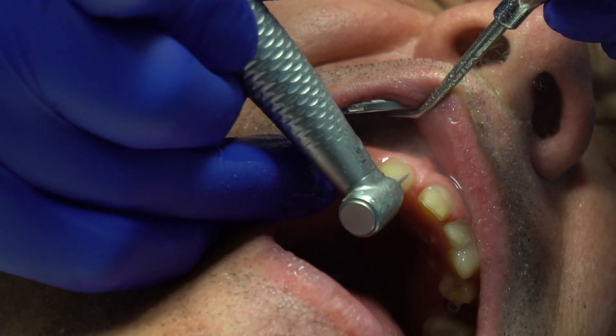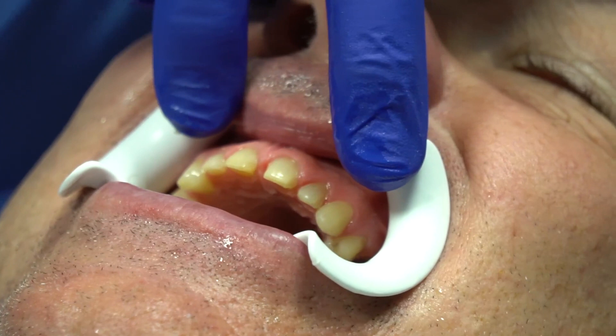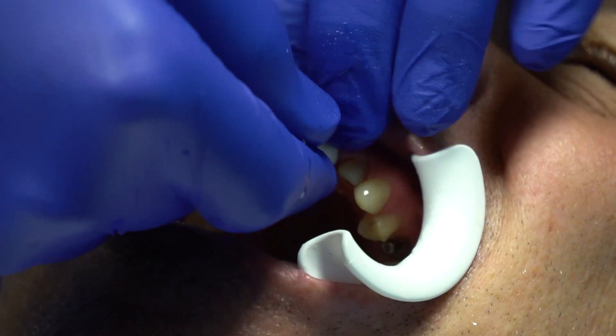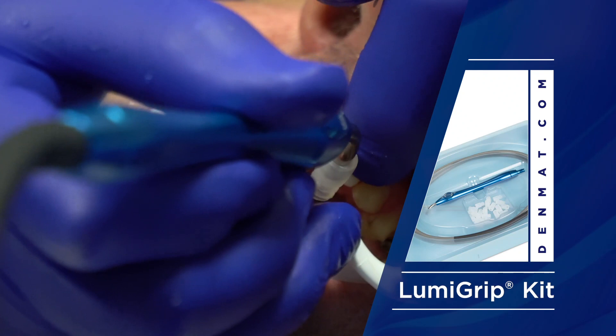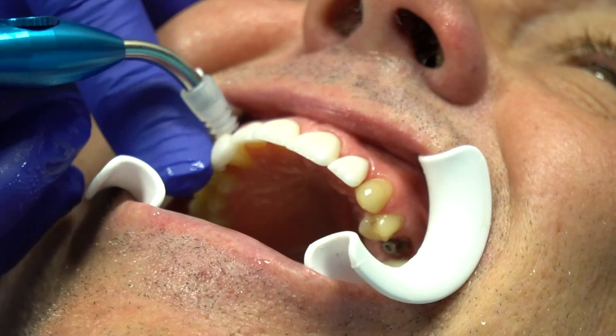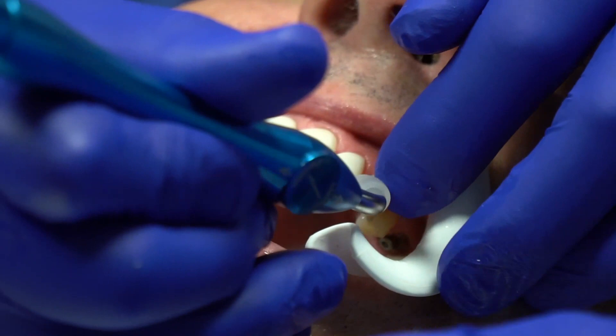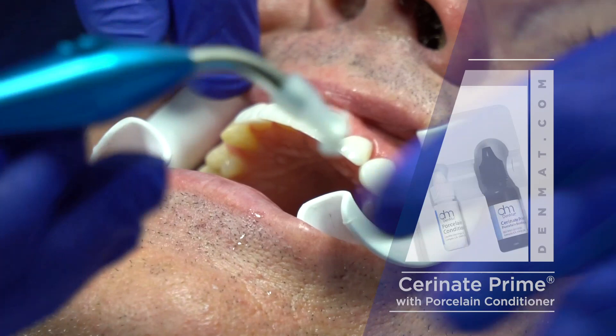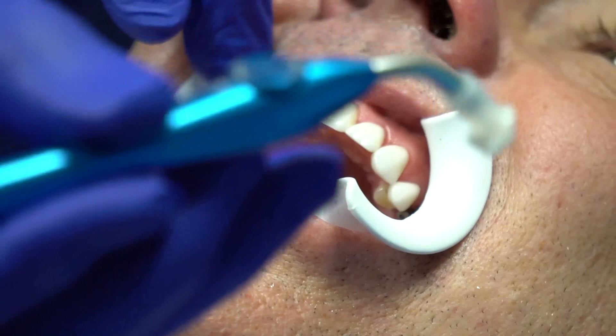Let's dry try-in. This is a Lumi Grip that actually holds the veneers in place. There's our dry try-in on the upper — I like everything. One of the things we haven't discussed is Joanna already silaned these veneers, which means she's already put the silane inside and we don't have to re-silane. If you look in here, the coating for the silane is in there.